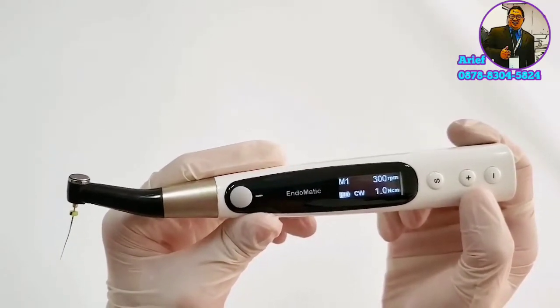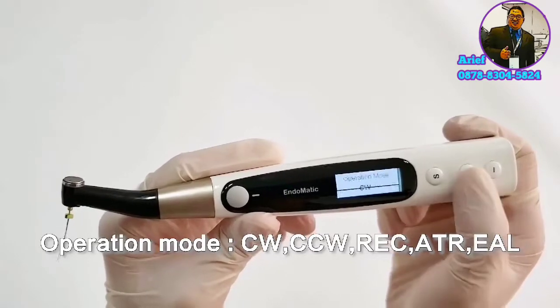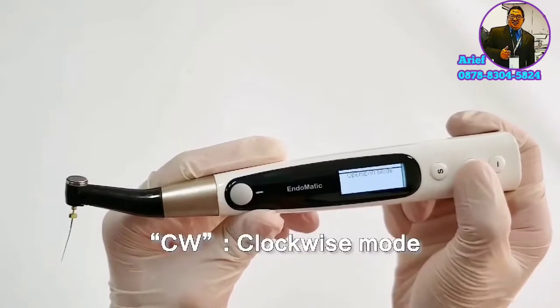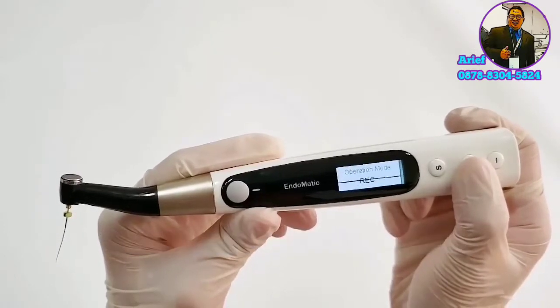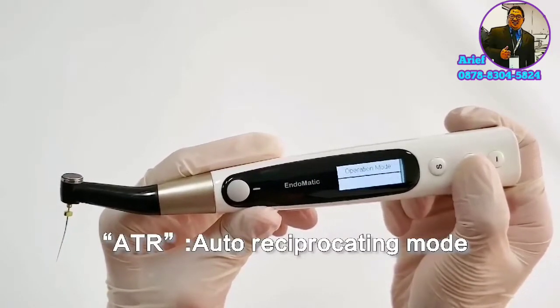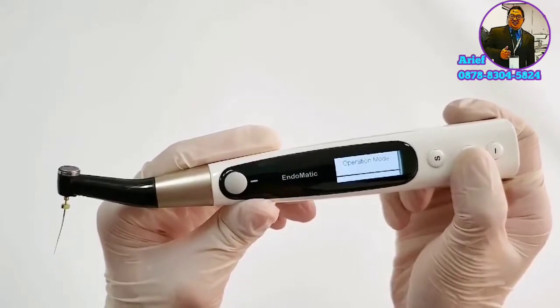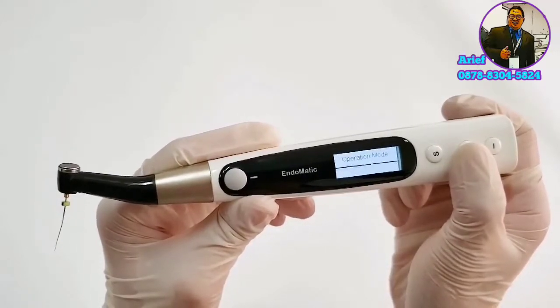Let's look at the detailed functions for Endomatic. Press the S button and we will see operation mode, including CW, CCW, REC, ATR, and EAL modes. CW stands for clockwise, CCW for counterclockwise, REC for reciprocating, and ATR for auto reciprocating — when the set torque is reached, reciprocating mode turns on automatically to avoid file fracture. EAL is apex locator mode, used for measuring root canal length.